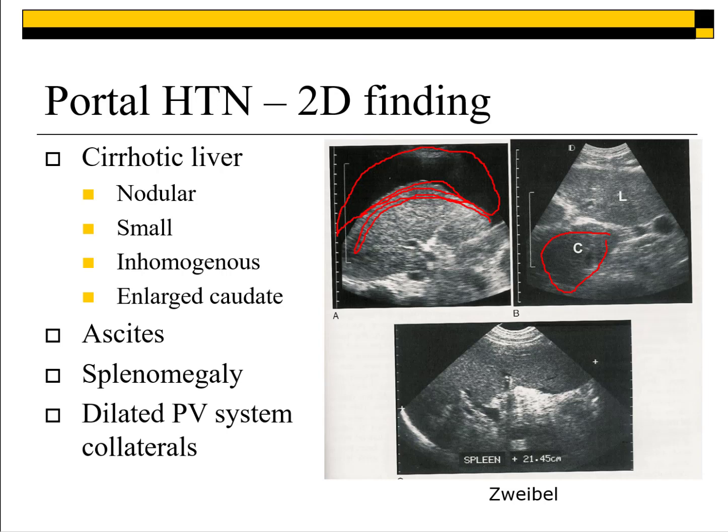So also, when we look at this, there's going to be some other sonographic findings with this. We talked about with the development of portal hypertension, that main portal vein diameter is initially going to increase because of that increasing portal venous pressure, right? But think about that. Eventually, once it gets more severe, not only is our flow going to slow down enough in our main portal vein, it's actually going to go hepatofugal in some severe cases.